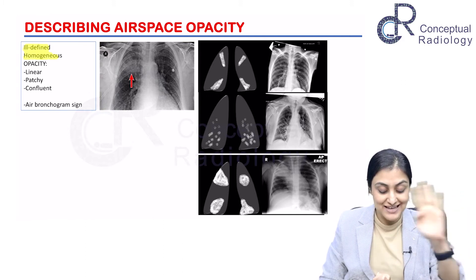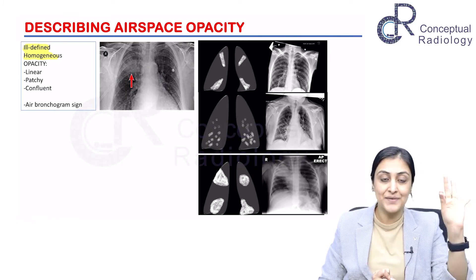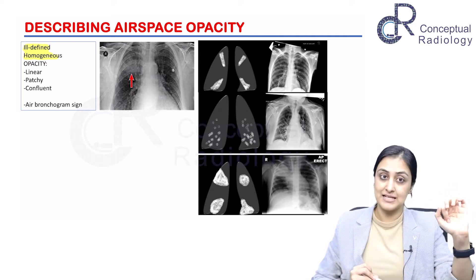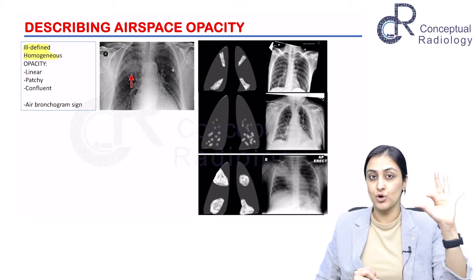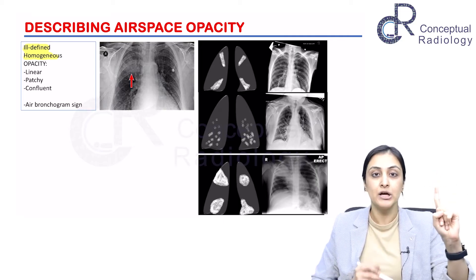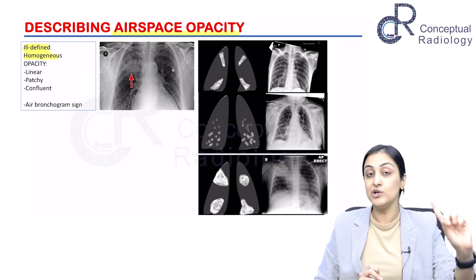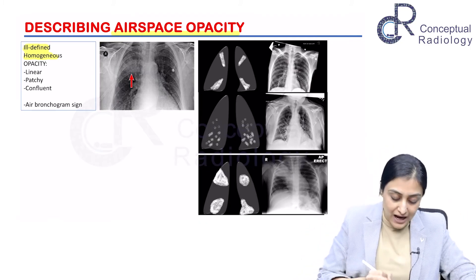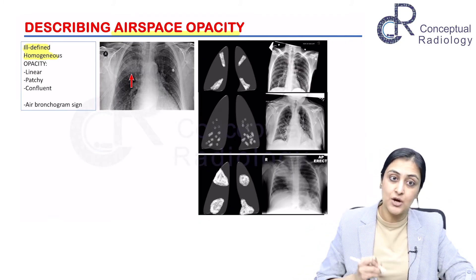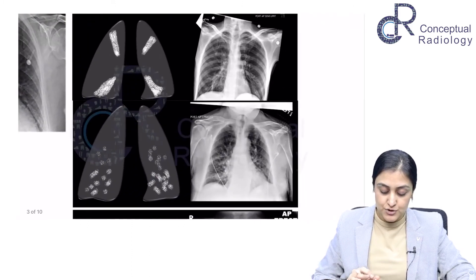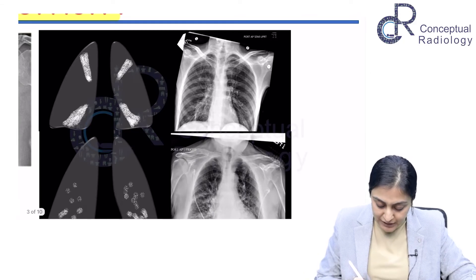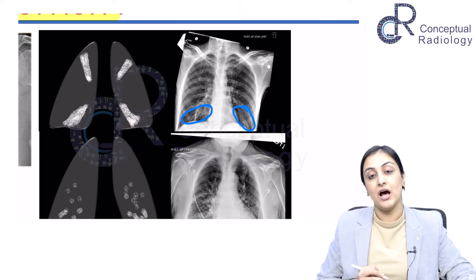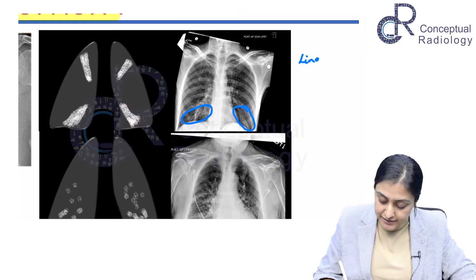It is ill-defined, meaning it is not a nodule or a mass, and it is homogeneous. These are our initial descriptive words. You then have three further sub-classifications of the opacity. What you say is: an ill-defined homogeneous opacity which is either linear, patchy, or confluent. Looking at this x-ray, you can see opacities which are ill-defined and homogeneous but these are linear opacities.